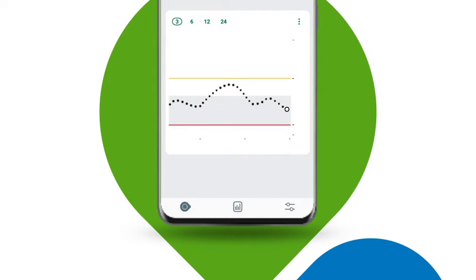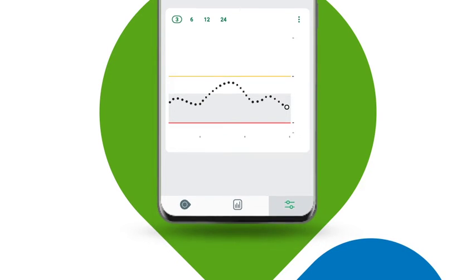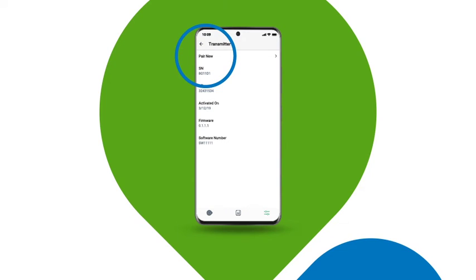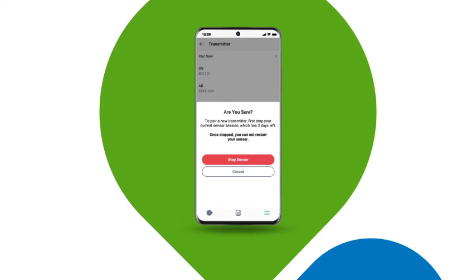There are times when you might want to end your transmitter session before it automatically expires. To stop your transmitter early, tap Settings in the app, then tap Transmitter, tap 'Pair New,' and follow the on-screen instructions to replace your sensor and transmitter.